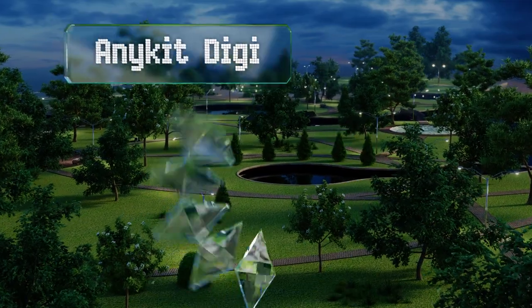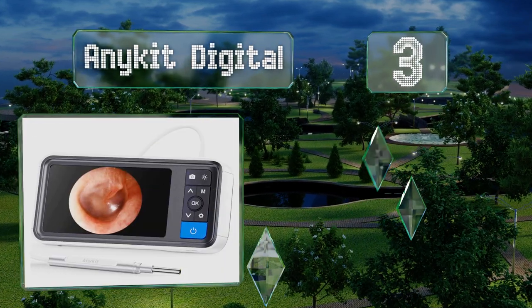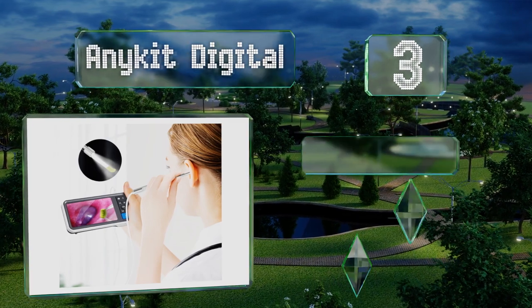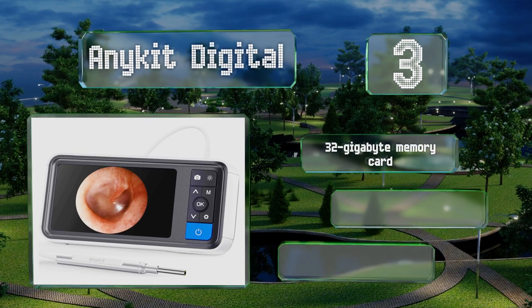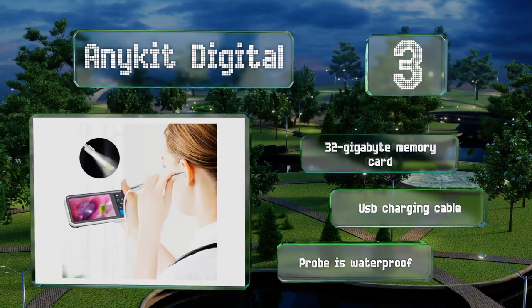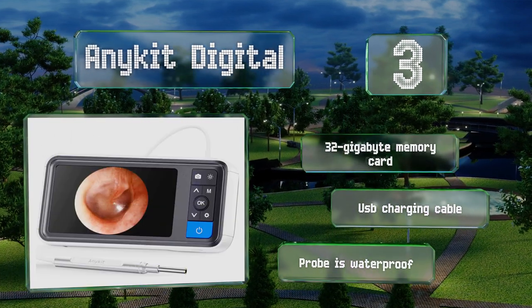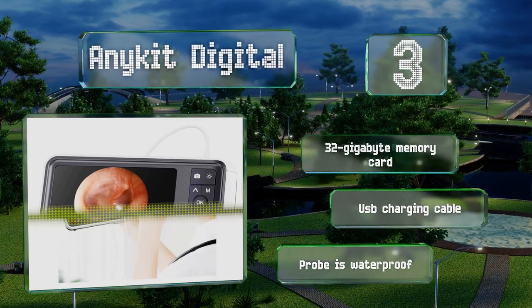Nearing the top of our list at number three, whether you're looking for excess wax or diagnosing an infection, the Anykit Digital can get the job done. Its three and a half millimeter camera probe is slim enough to access most human ear canals, while the four and a half inch color monitor can display high definition photos and videos. It includes a 32 gigabyte memory card and a USB charging cable, and the probe is waterproof.